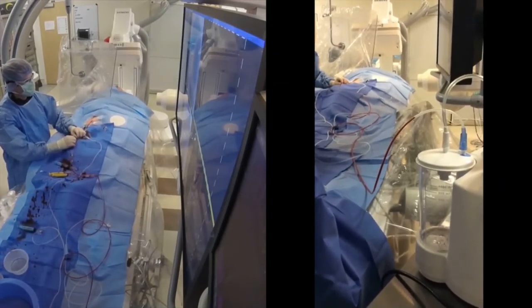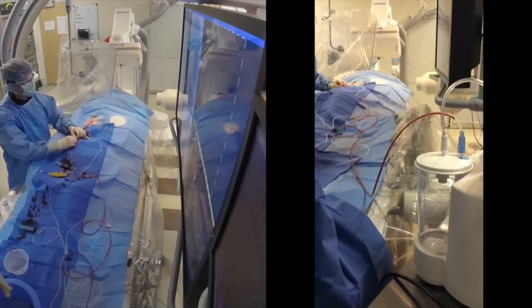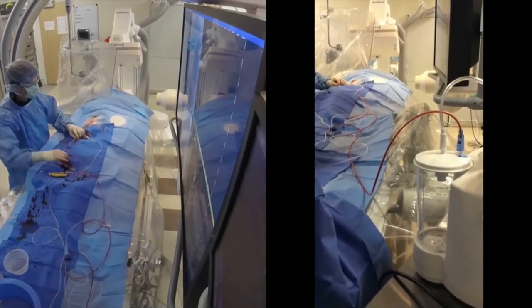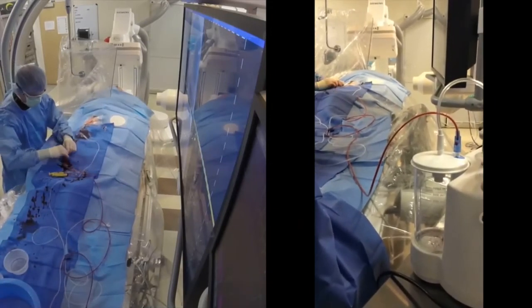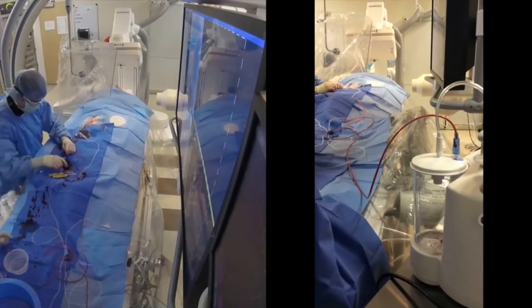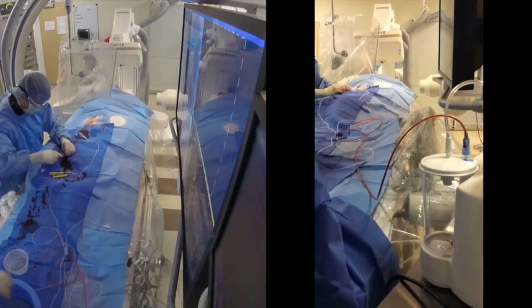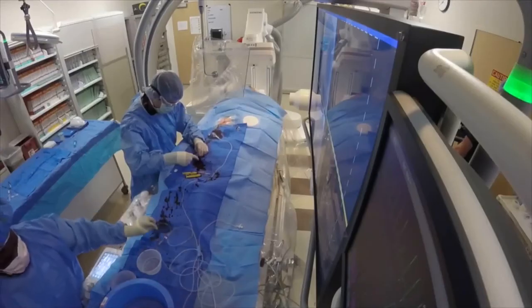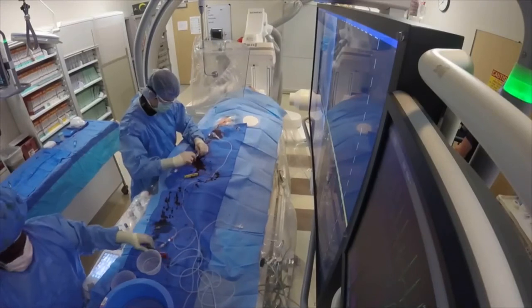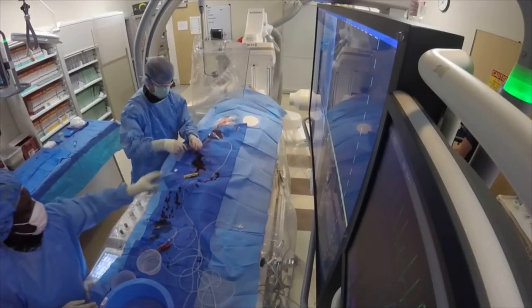We've now disconnected the vacuum tubing and we're doing a quick angiogram. This demonstrates that we have, in fact, removed the clot and restored normal blood flow to the brain — and it's only taken us about four and a half minutes.